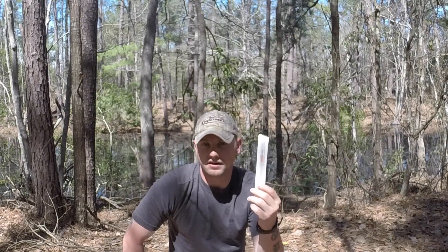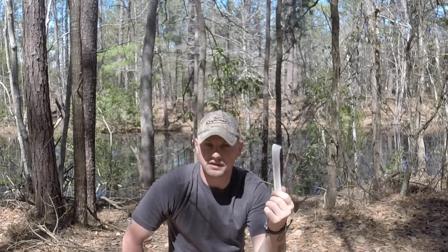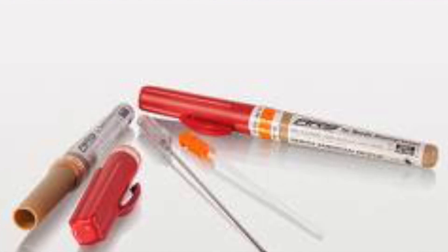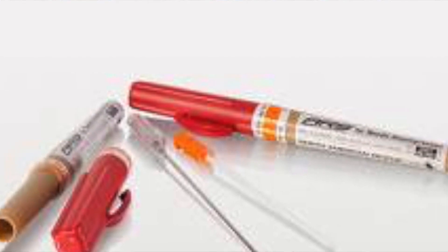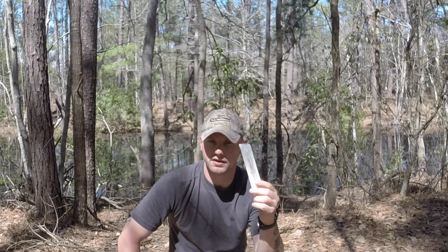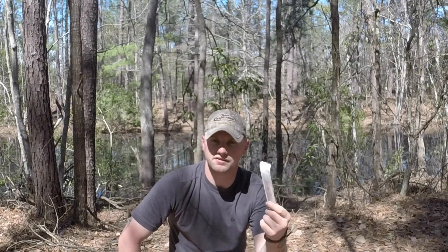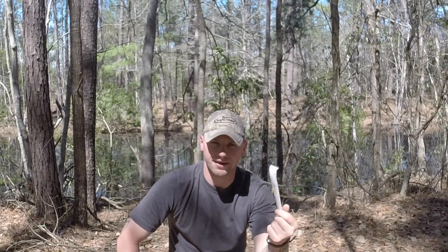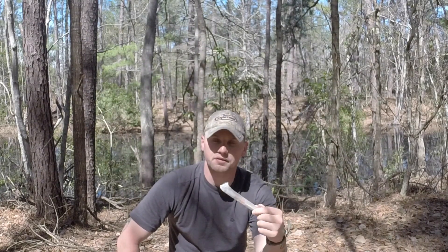The major thing we need is a needle designed for this. They make different kits — this is a more old-fashioned one the army used to issue, but there are kits you can buy now that aren't very expensive. They come in a hard plastic container so the needle doesn't get damaged rolling around in your combat gear. It's typically a 14-gauge needle, though 16-gauge exists, and for children and adolescents an 18-gauge is recommended — though most people just carry 14-gauge and figure it'll work for kids too.